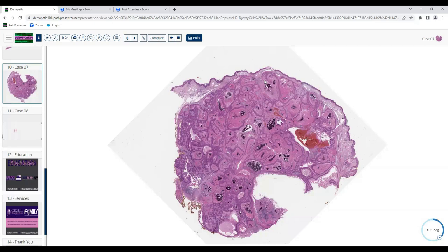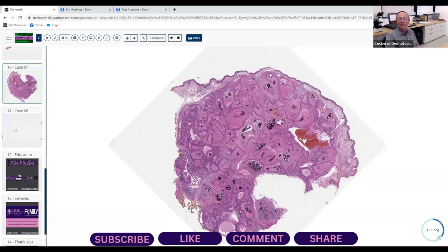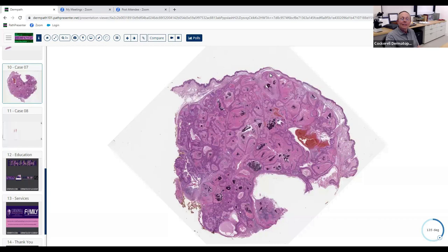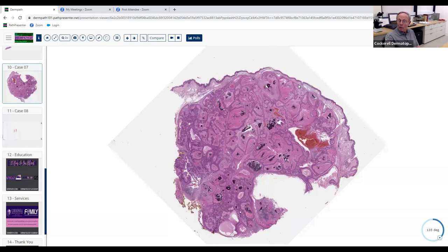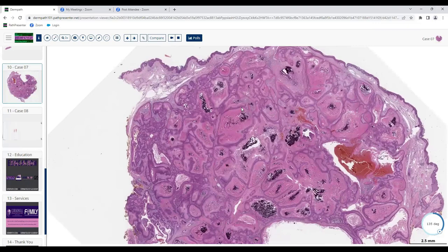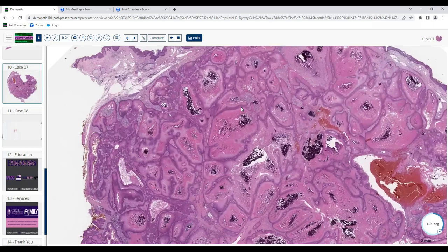There are several good reasons it's benign at low power. If you draw a line down the middle, it's quite symmetrical — and well circumscribed. It's fairly large, but very symmetrical and well-defined, which favors benign. You think it's epithelial — yes, with these rolls and scrolls — and those structures have epithelial-looking cells at the periphery with what looks like keratinization immediately following, which is a sign of epithelial differentiation.